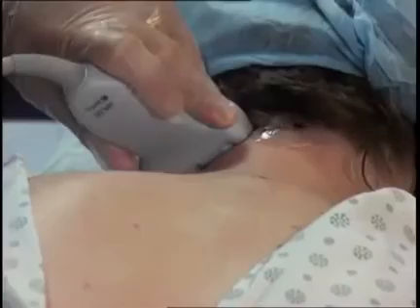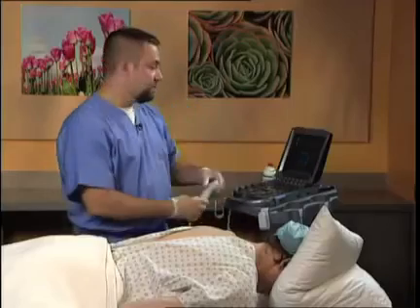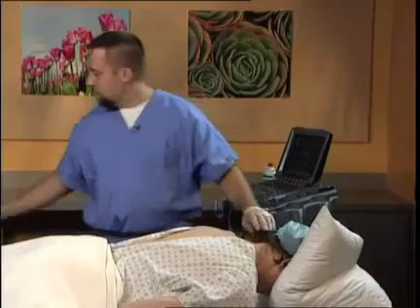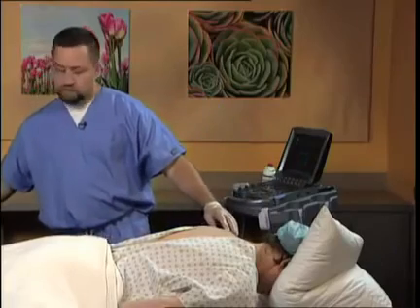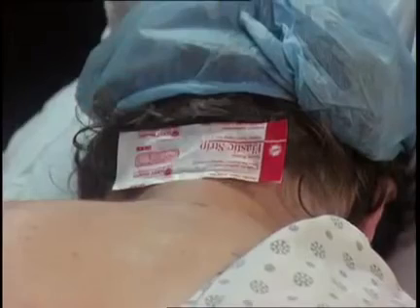The needle is removed and then the probe placed, the area cleansed, and a band-aid placed over the incision. This concludes the successful placement of a greater occipital block under ultrasound guidance.